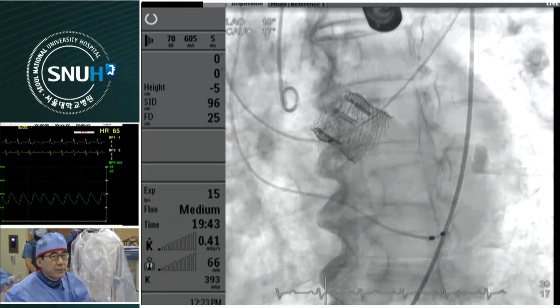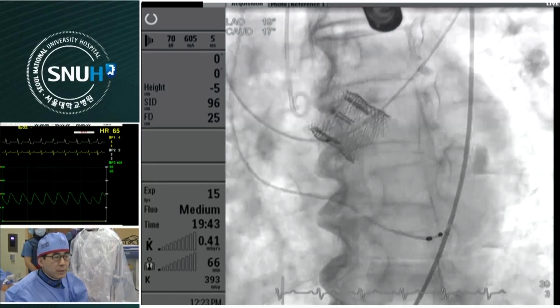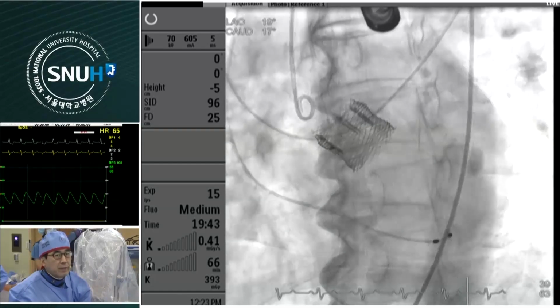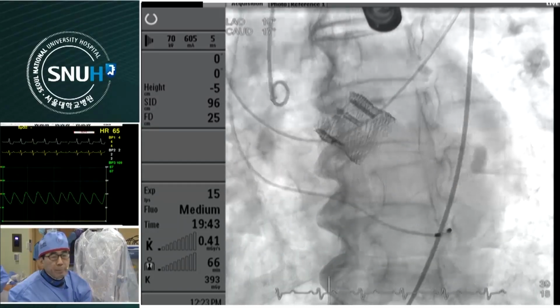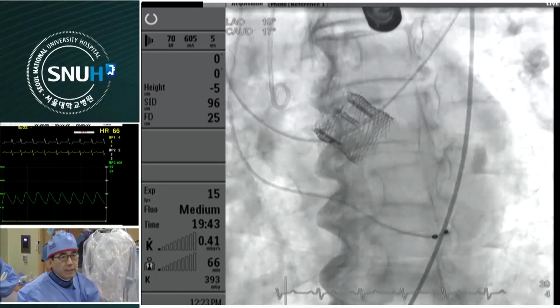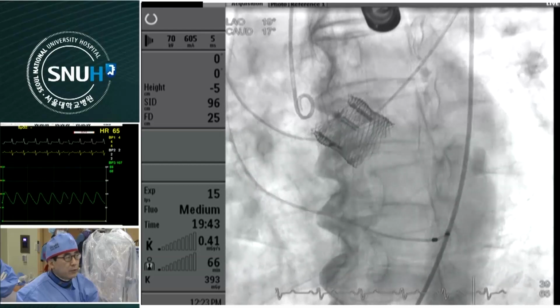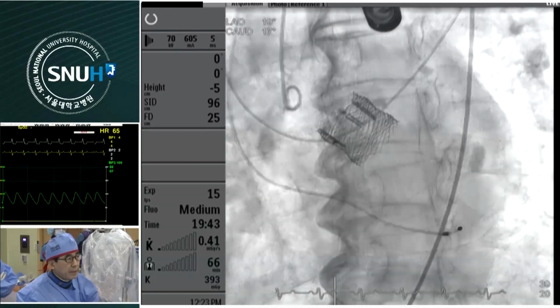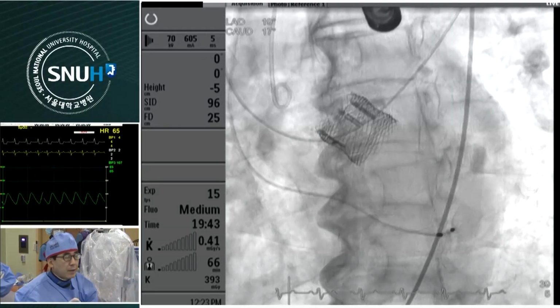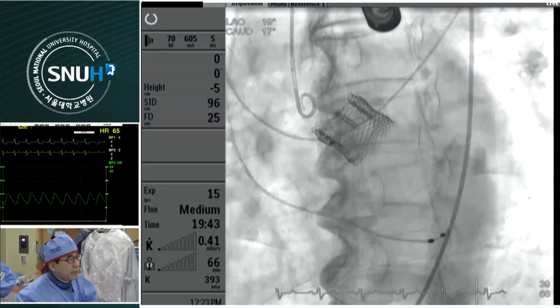The true indication for TAVI is age. Thus, when TAVI valve leaflet durability is confirmed, the prototypic therapeutic modality for AS would be TAVI. Thus, we have to wait for the durability of TAVI valve leaflet. And industrial partners really put their investment into prolonging the durability of TAVI valve leaflet.